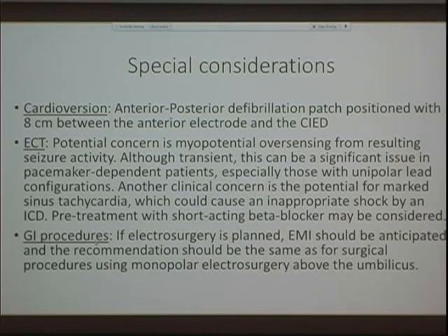For GI procedures, if electrosurgery is planned, like snipping, then you have to treat them like any other patient undergoing surgery above the umbilicus. But if it's going to be a routine check, then you really don't need to worry about it. So it's again the electrical component that can cause the EMI, and these patients should be treated like any other above the umbilicus patients.